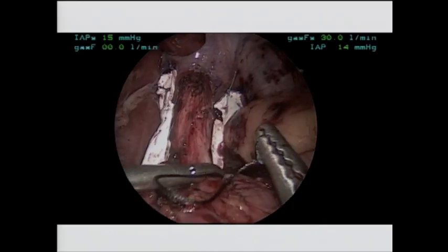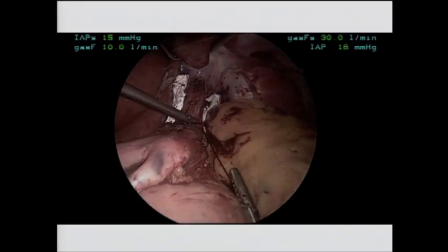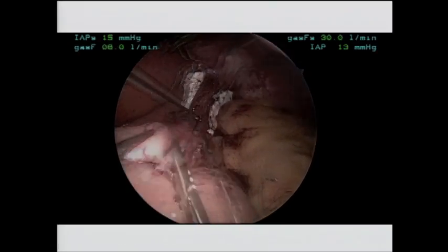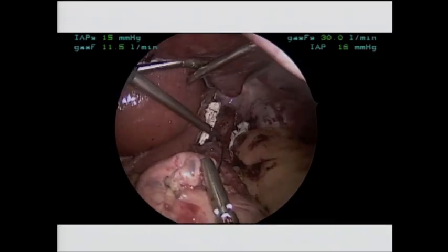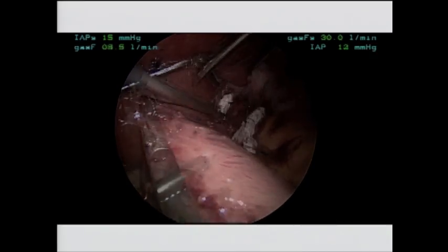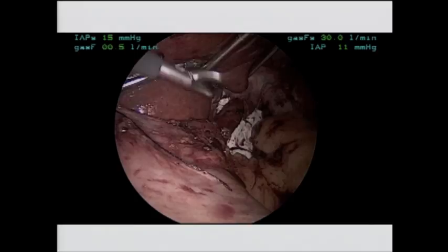So I'm going to show you the actual technique right now. And so we're identifying the distal end of the left side of the esophagus. And this suture has been pre-measured and cut based on that little table you just saw. And starting where the fundus meets the left side of the esophagus, we just stretch it straight. And now we've used that like a little ruler and measured out along the greater curve. We're going to retract that to the patient's right and inferiorly, flatten the back of the fundus, and simply swing it over until visually it makes an equilateral triangle.